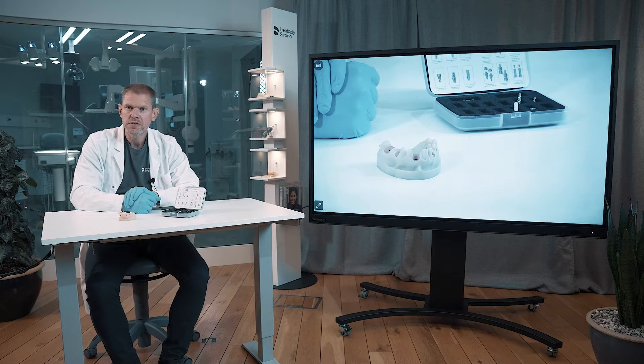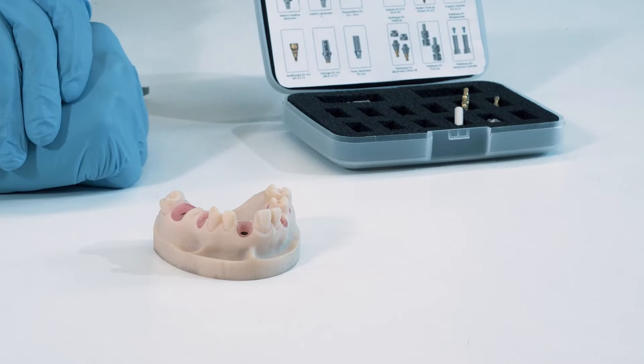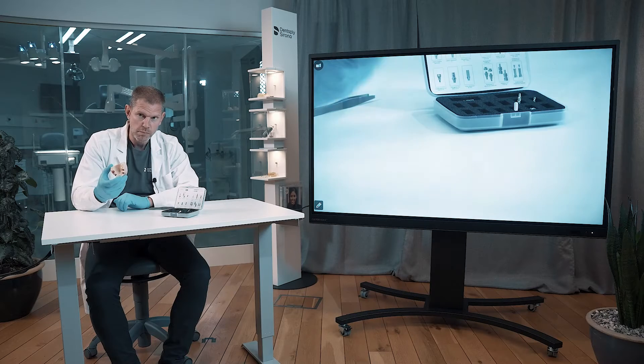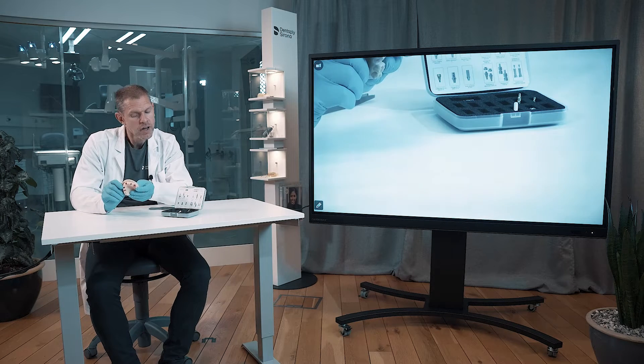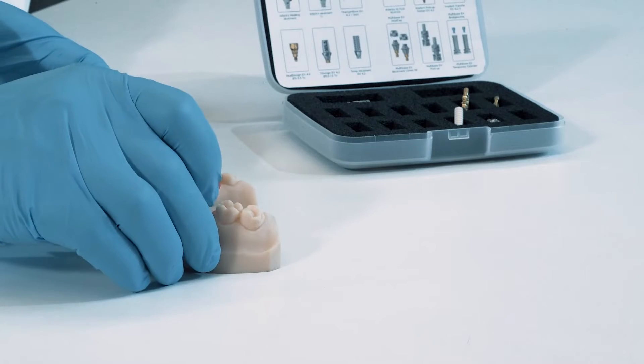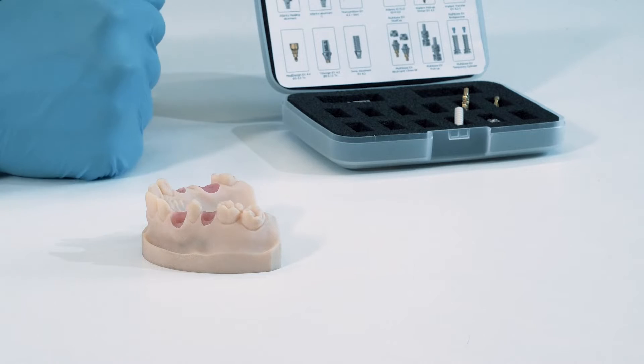Welcome to the restorative hands-on for the prosthetics for the DS implants. What you see here in front of me is the new model for the systems and the restorative parts. We also have this box with a lot of restorative components.